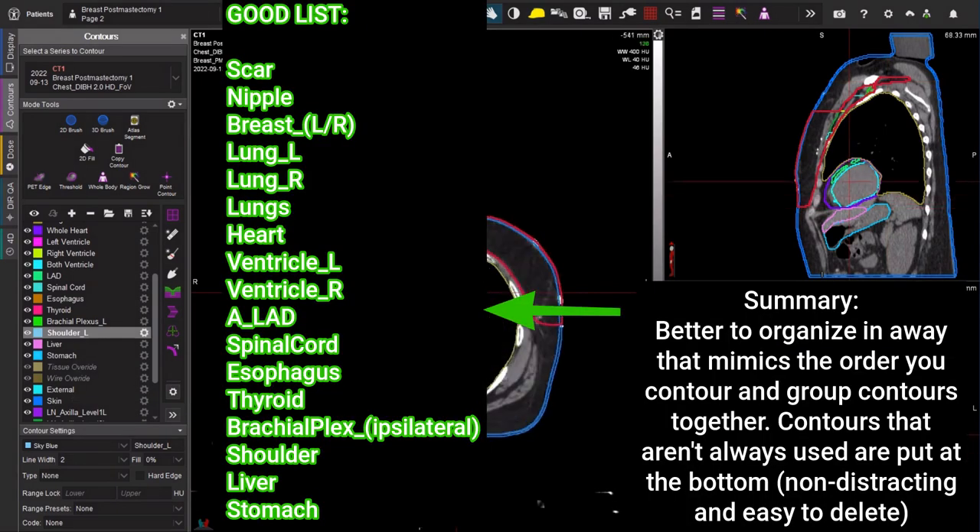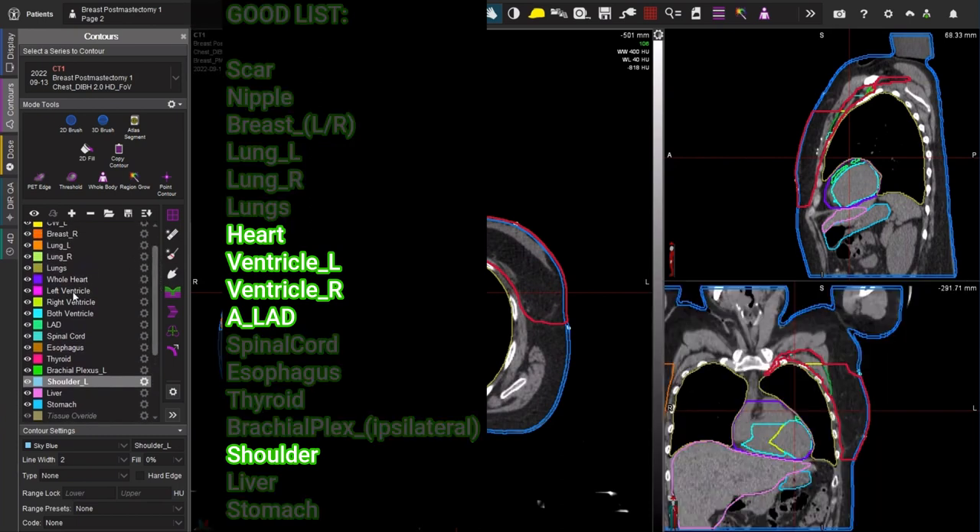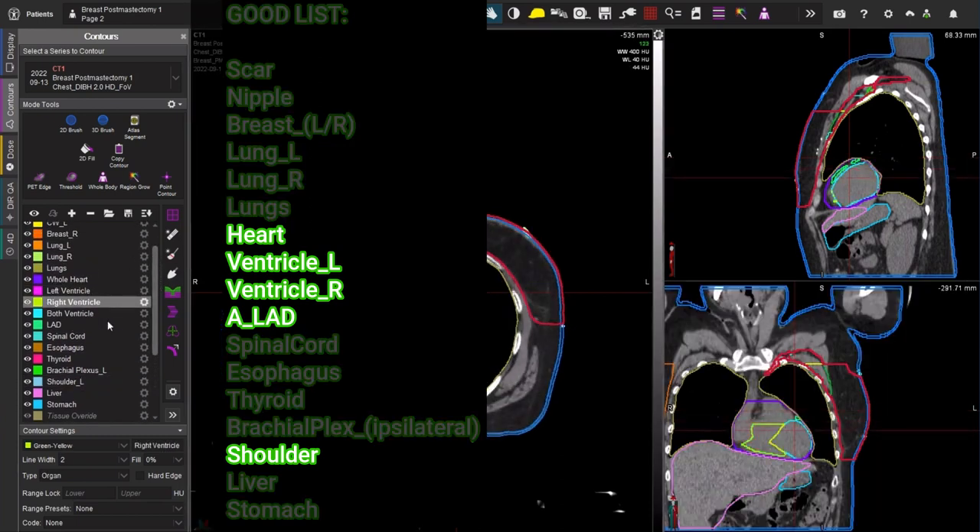Many of these OARs should be familiar to you, but the ones I'm going to focus on are the ones that we don't routinely contour for other disease sites. That includes our left ventricle, right ventricle, our left anterior descending artery, and then the shoulder.